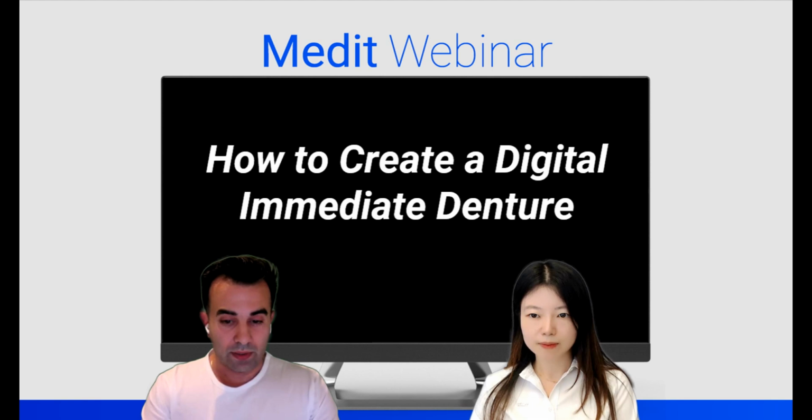Once we moved towards digital, and once I started to understand these tools and how to use them, today we do a digital try-in. We don't need a try-in anymore. We rely on photos and we do the smile design.